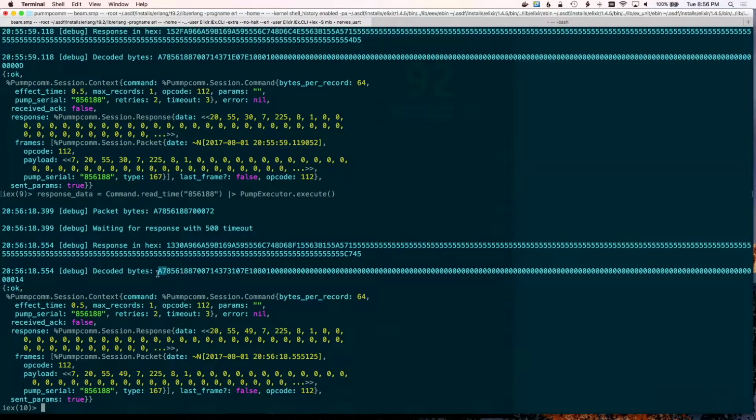So this is basically saying I'm MiniMed. I believe A7 stands for the pump communicating. And then after that, some serial number stuff. 70 is that command that we sent. And then there's stuff that comes back after that. And so somewhere encoded in this is the date and the time. And should be fun to try to pull this out.